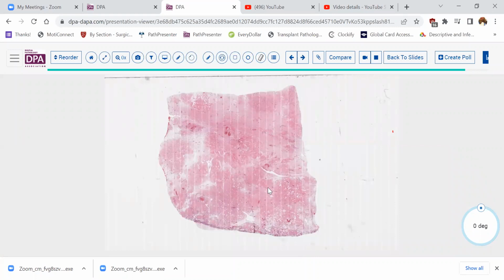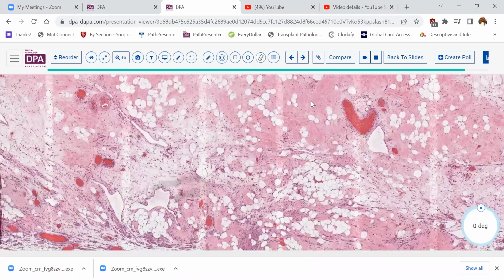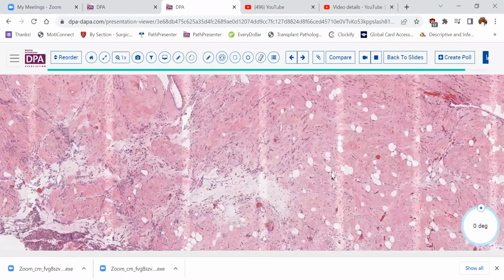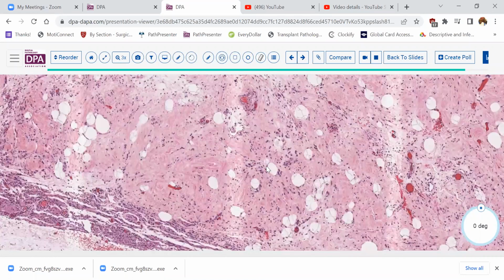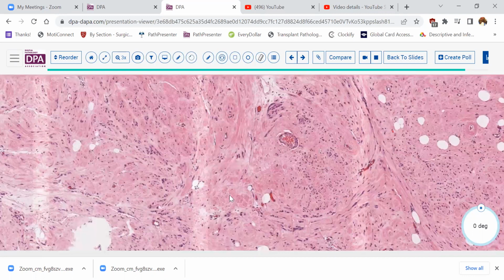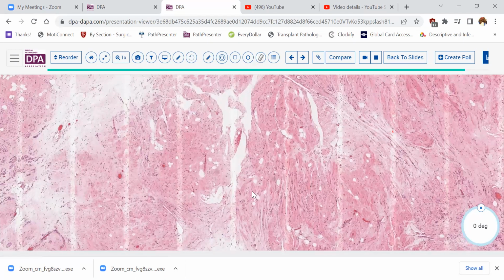Now, this last case that we'll do here, again, not a significant diagnostic challenge, but an interesting situation. So this patient had a myomectomy for an enlarged uterus, and it was obvious that they had an intrauterine mass. And I think, as you can see here, we have some fat-like cells, spaces with clear cytoplasm, and we have smooth muscle, along with this sort of hyalinized and fibrous stroma. And so this is a lipoleiomyoma. Now, the differential for this might include things like angiomyolipoma, sort of a PEComa type of lesion, or just a leiomyoma.